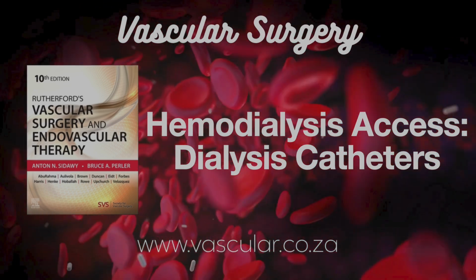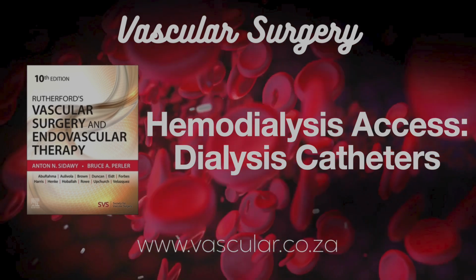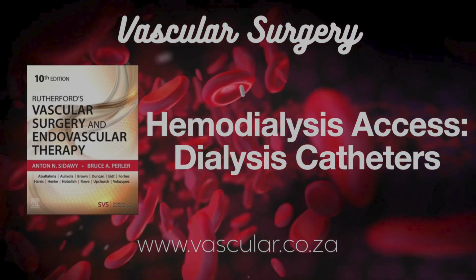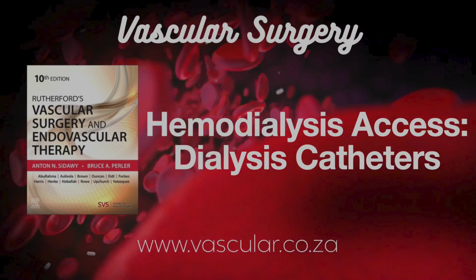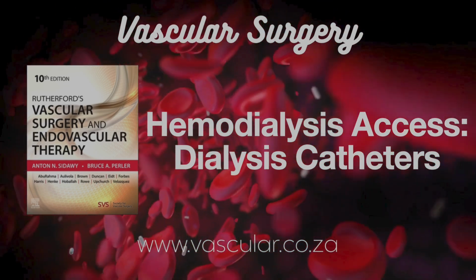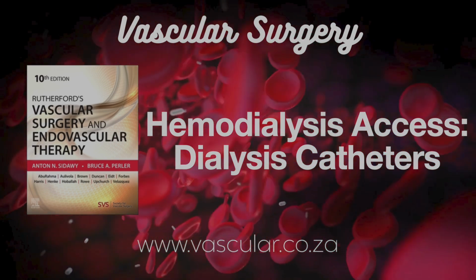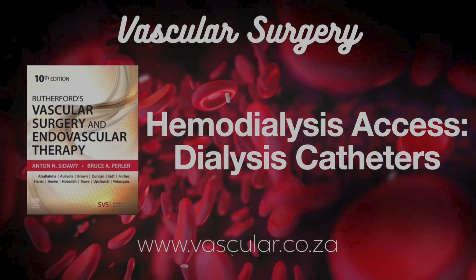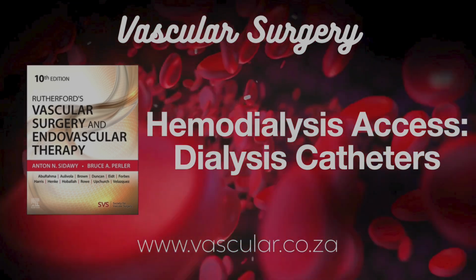We always get an upright chest x-ray after placement, which confirms tip position and checks for pneumothorax. If someone suddenly gets short of breath or has chest pain and looks distressed, they need a chest tube put in right away to let the air out, plus oxygen. What if it's small? If it's small and the patient feels okay, oxygen levels are fine, we might just monitor with repeat x-rays. But if it gets worse or symptoms appear, they get a chest tube. Often a small pigtail catheter works well and is better tolerated.